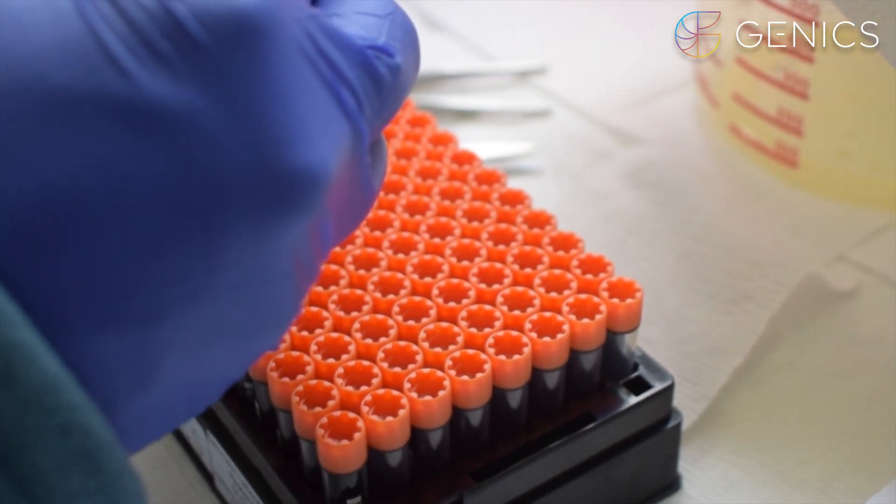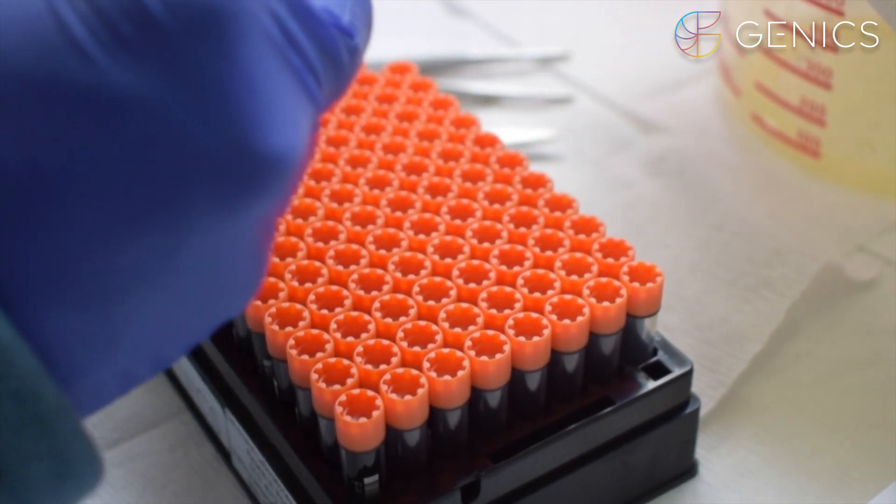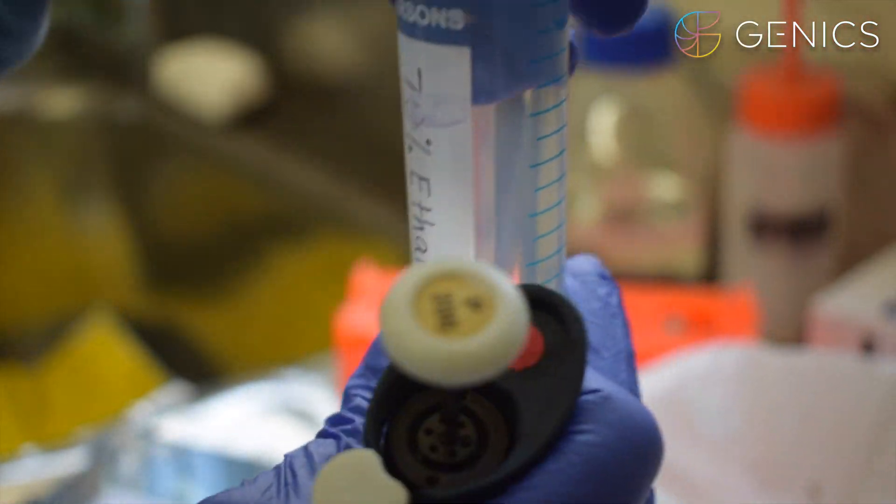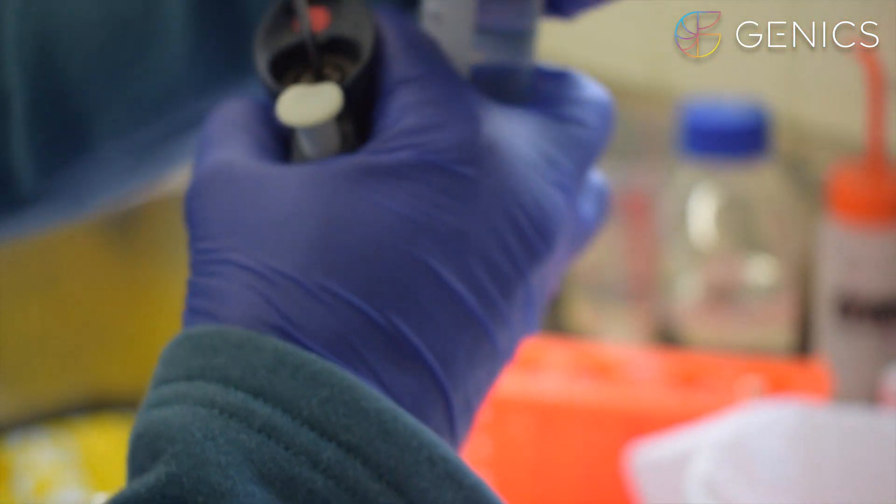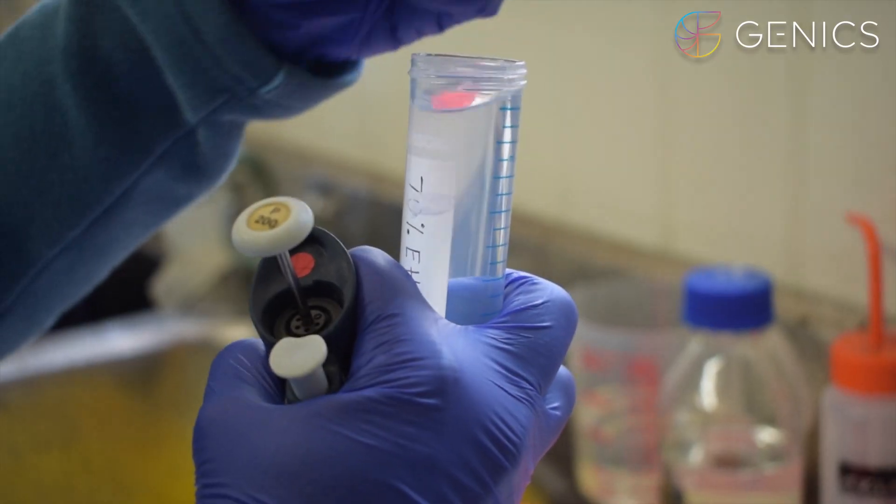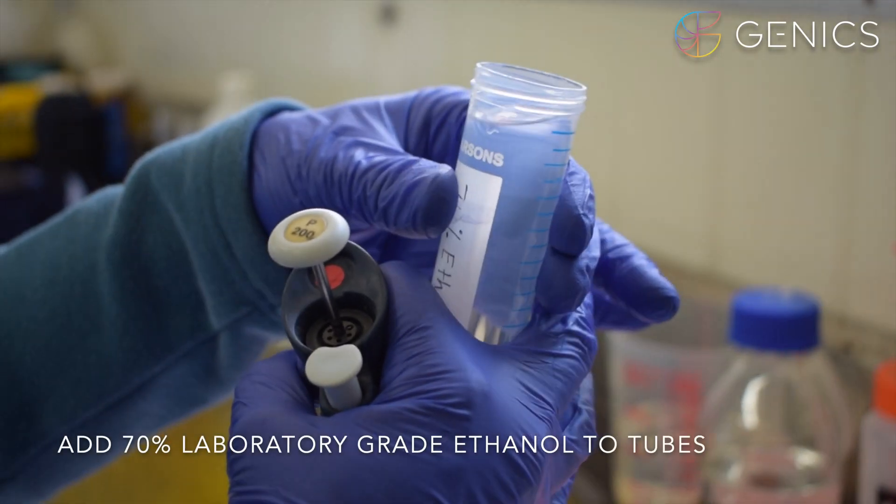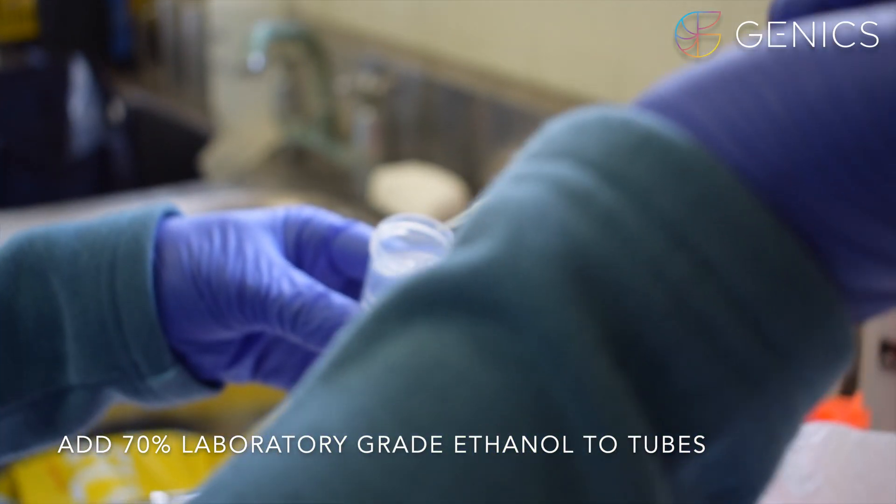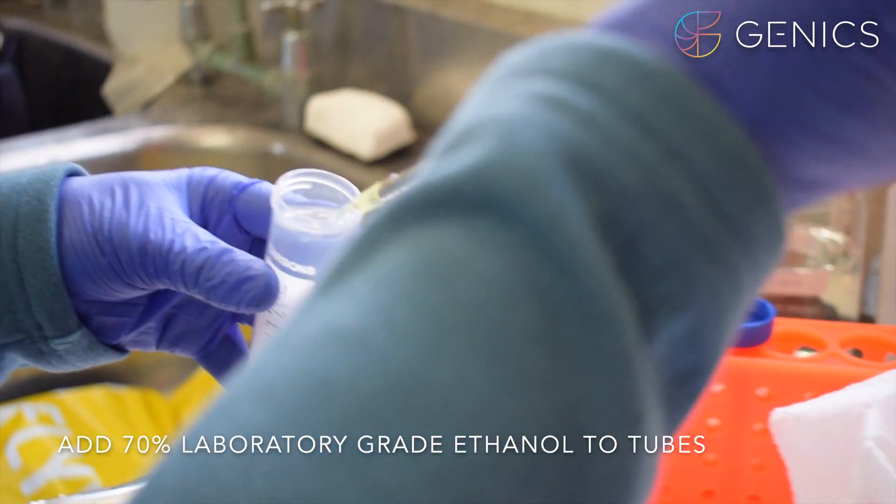You then want to unscrew your orange tube lid and sit it back into the rack. Then you add the 70% laboratory grade ethanol which is your fixative. You can put anything from 600 microliters to 1 ml of ethanol into your tubes.